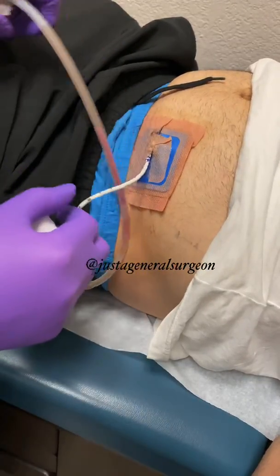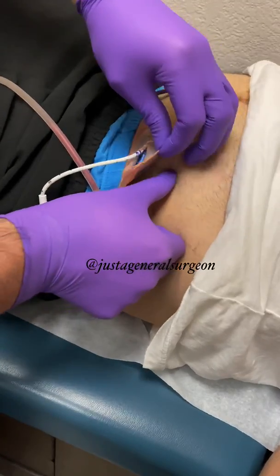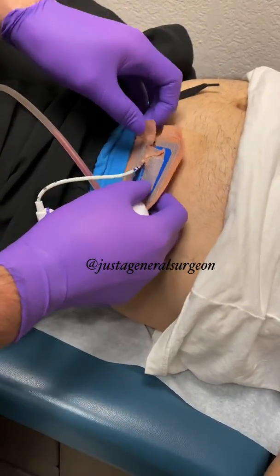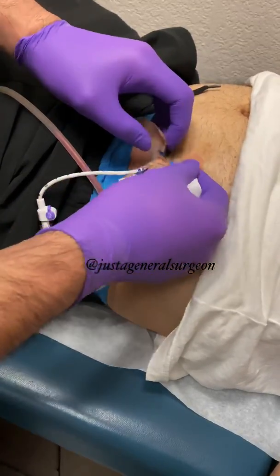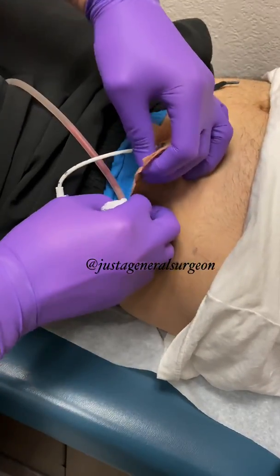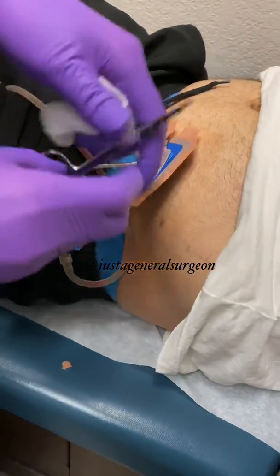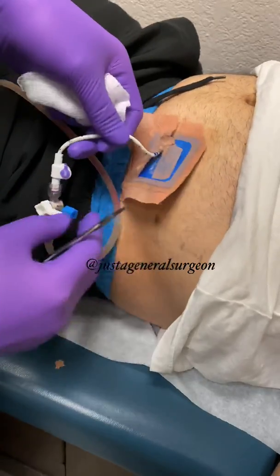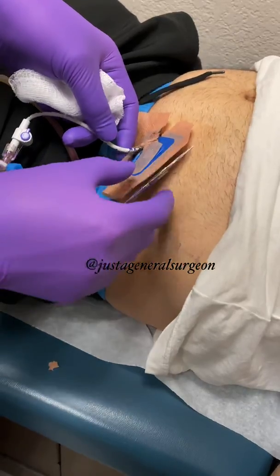We're going to take the bandage off. Got to be careful not to yank anything out prematurely. This looks like a pigtail drain, and here's a suture holding it in place.